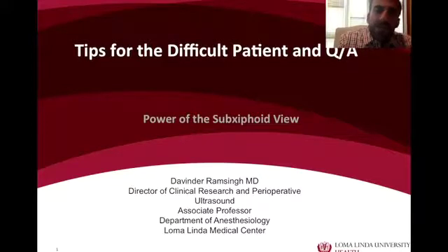Today, this module will talk about the subxiphoid view, but really with the take-home point that the subxiphoid view is really an ideal view that should be thought of when we're intubating a difficult patient. We're not able to have access to the chest, or the chest windows, meaning the parasternal and apical windows, are difficult to find in the patient.